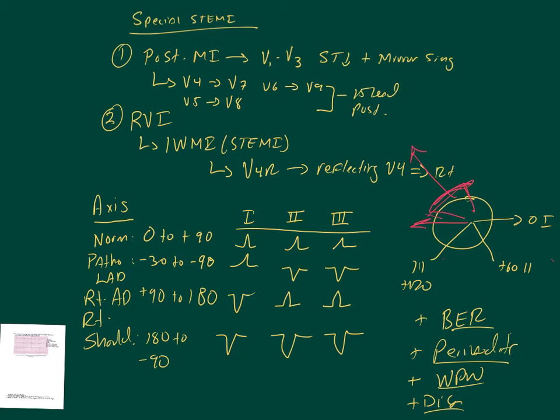You guys remember that from last week? And at that point, we hadn't had a lot of nuanced 12 lead stuff, right? And so what did I say? What was kind of the guideline that I gave you guys last week? Treated as a STEMI, always, or if you married it up with the signs and symptoms and your assessment of the patient. Good. So if your patient has signs and symptoms of acute coronary syndrome and a new onset or a presumably new onset left bundle branch block, you would be pretty well justified in treating that as a STEMI.